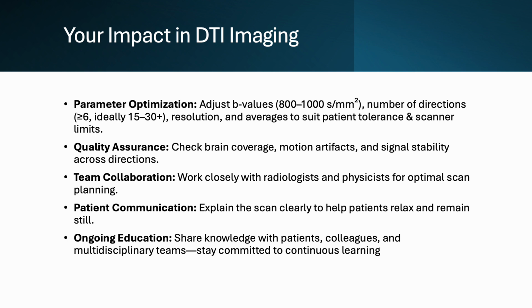DTI is also a team sport, really. Many planning decisions require collaboration with radiologists and the physicist, so maintaining open communication is essential. And of course, our interaction with the patient can directly affect the scan quality. So clear explanations help the patient relax and stay still during the scan. Lastly, we are educators, not just for patients, but also for junior colleagues and multidisciplinary teams. So share what you know, stay curious, keep learning, and keep doing your best.